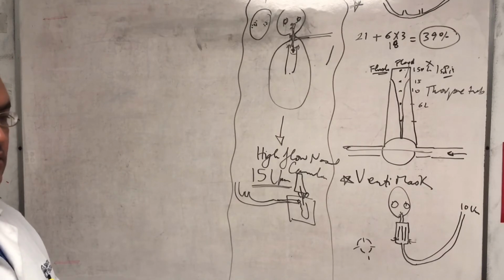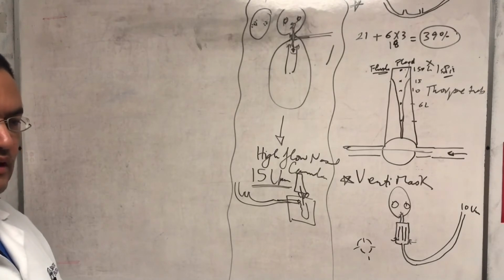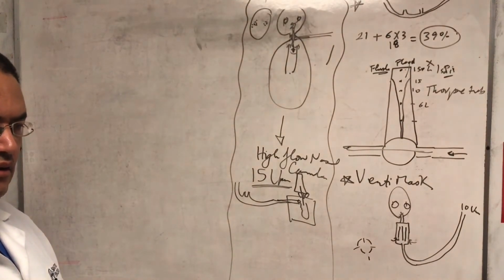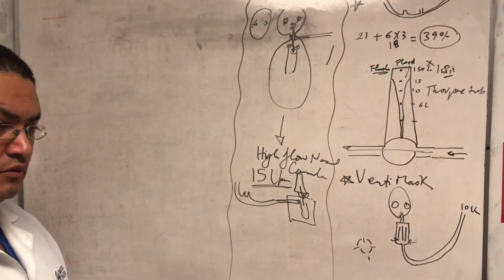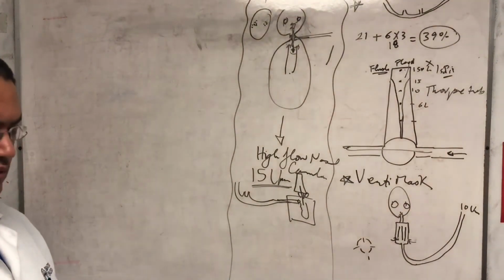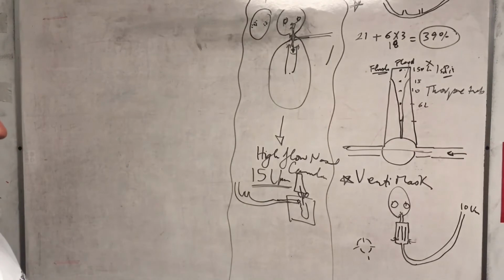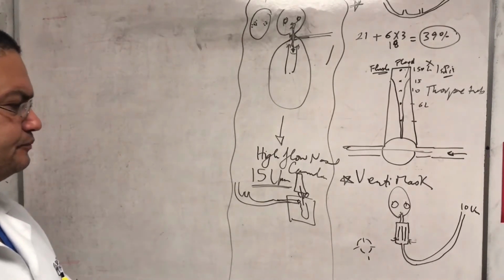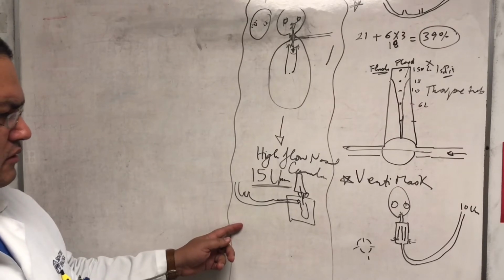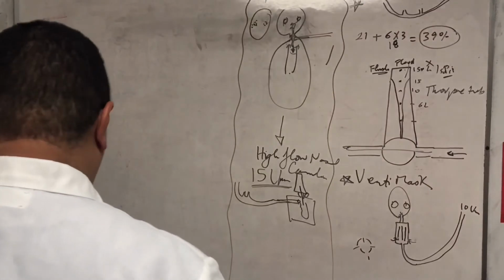That was an amazing development here in this hospital, because we could now leave patients on the floor up to 15 liters per minute. It really helped us a lot, especially during COVID. People stay on the floor until they reach 15; if they go higher than 15, then we take them to the ICU, depending obviously on their work of breathing and stuff like that. So that's your high flow nasal cannula. It's a little bit bigger in size.